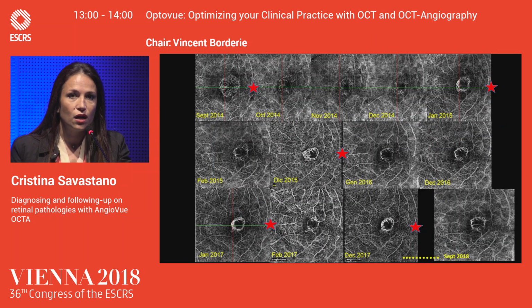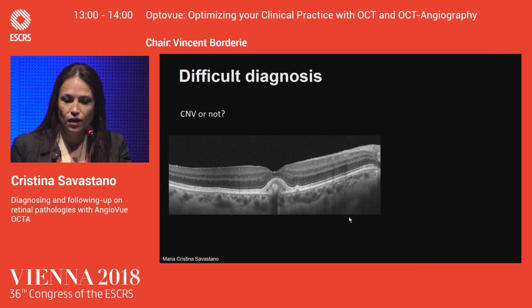By the use of OCT angiography, it is possible over the time to study the evolution of CNV during the anti-VEGF treatment, like in this case, after a few days, it's possible to observe the reduction of CNV. And this is practical in a clinical setting without dye injection.